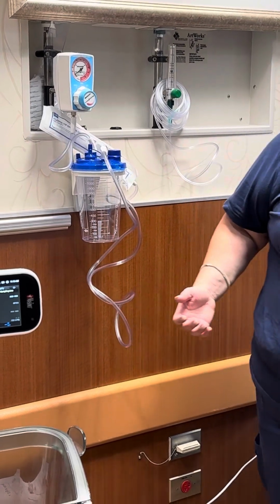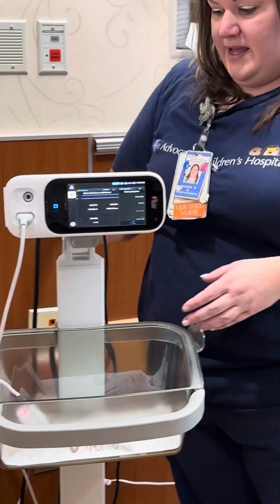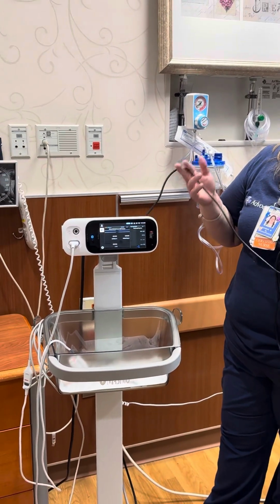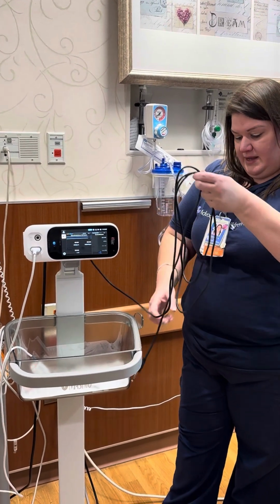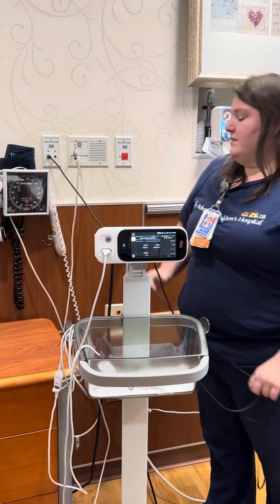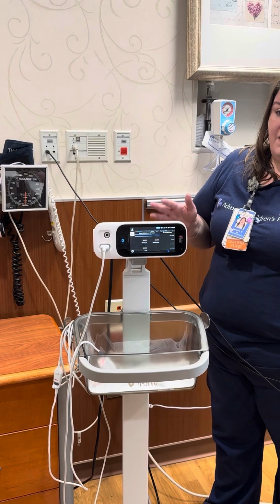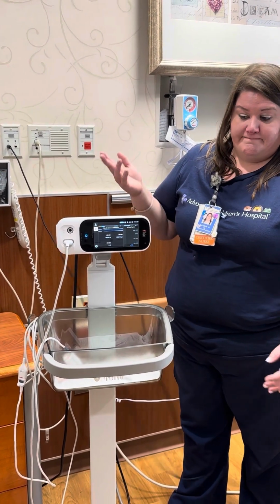The last piece is if you're hooking up a pulse ox. So you have your pulse ox machine. This one happened to come with the cable attached, but if you don't have one, there are extra in the high-risk cubby. This goes right into the back of the machine, and then you take your other end and you plug it into the responder IV, number 1, so that if the pulse ox starts to read low, it will alarm as an AUX alarm for this room. That's it.